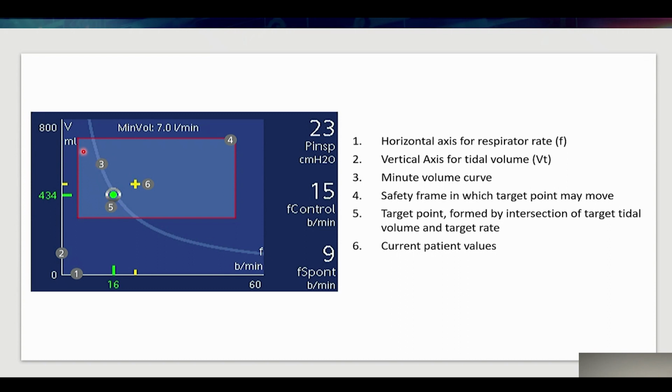So this little line is my respiratory rate times my tidal volume. All across this equals 7. This is everywhere across the Cartesian plane from 6th grade, everywhere where the number equals 7. The product of x and y equals 7. Are you guys cool with that?